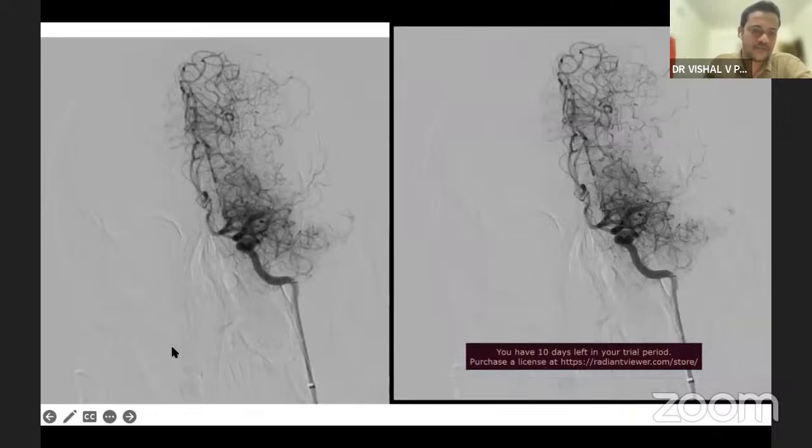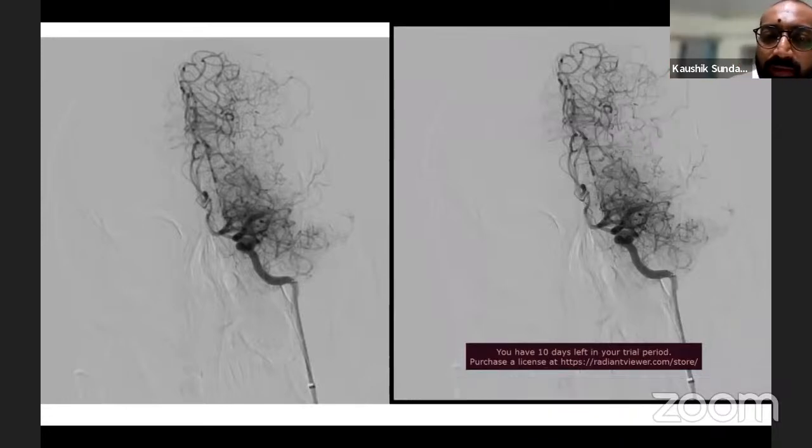Common carotid, no, sir. Patient was. Because I wanted to see how your distal IC was forming. Could you have seen the clot? See, what happens is, what is the theory? The theory is that we are probably dealing with a chronic stenosis that got occluded now.